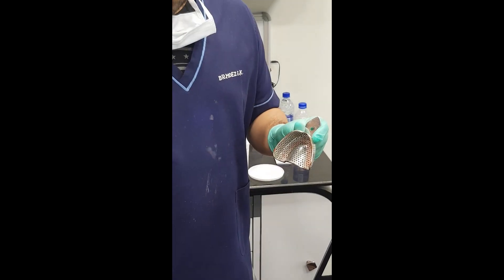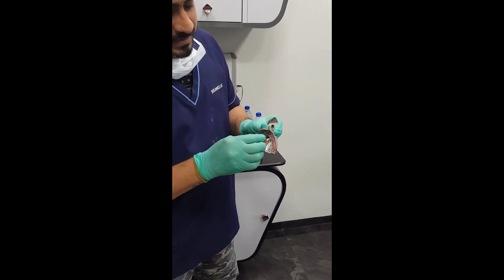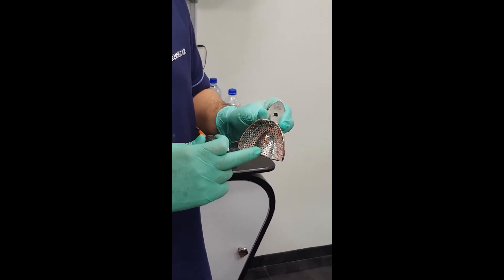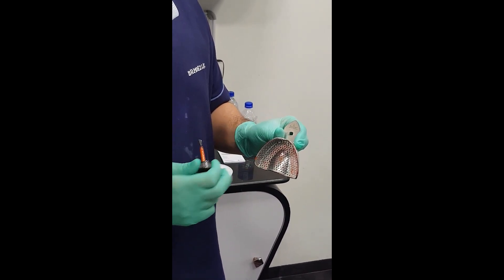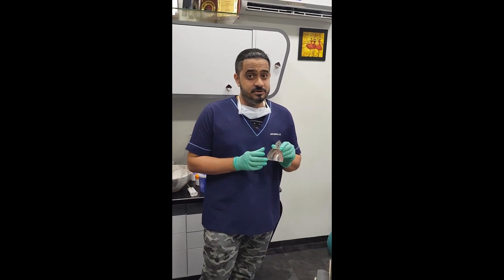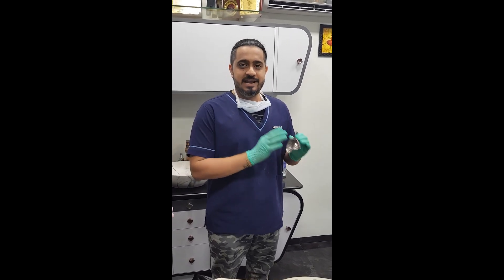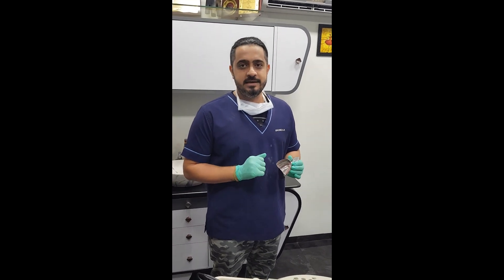Now because we're making a diagnostic impression for a splint, I will also apply tray adhesive in the center of the palate, because I intend on recording that area. If I'm regularly making an FPD impression, I would not apply tray adhesive here — I would apply it only and only over the occlusal surfaces and the peripheral rim. What is important to remember is the tray adhesive needs time to set — that's when it becomes sticky — and that's between four to six minutes. So don't be in a hurry. It helps to select a tray and apply the tray adhesive beforehand, and then go ahead and register the impression.